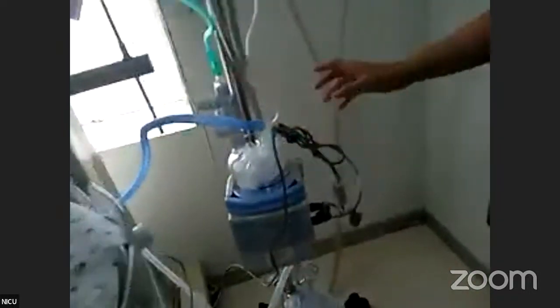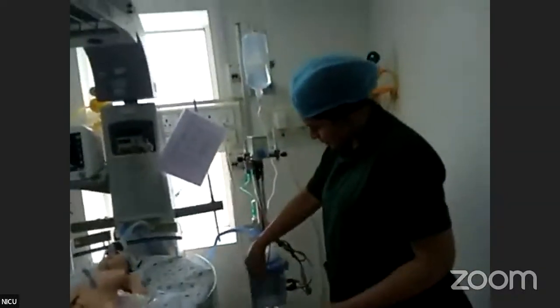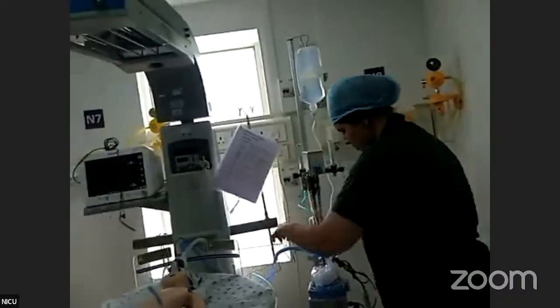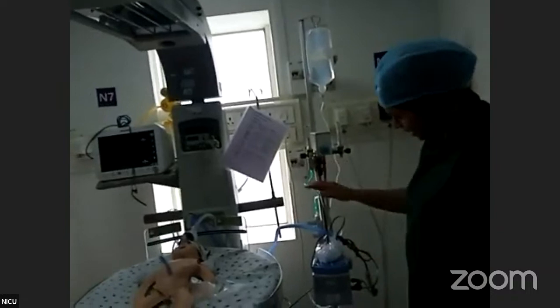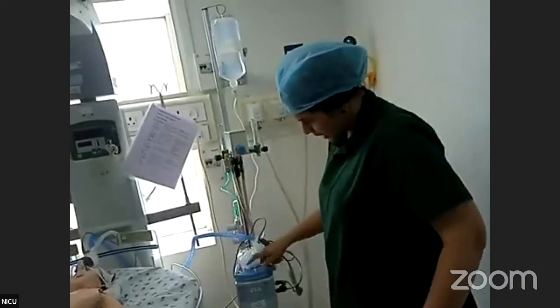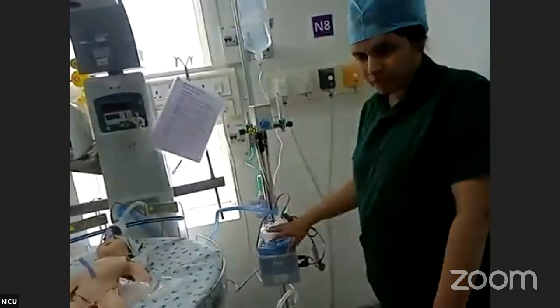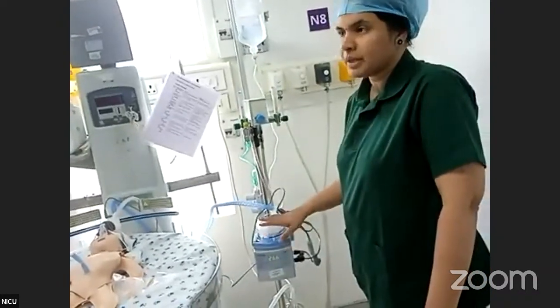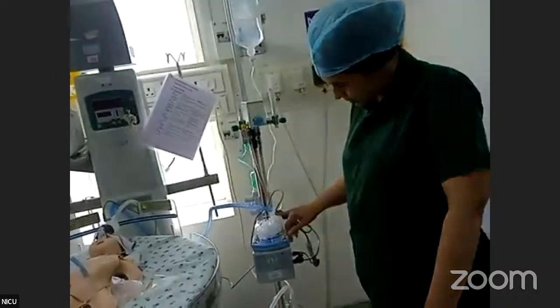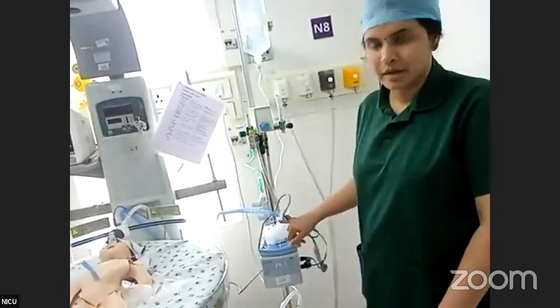Now, another very important aspect of monitoring is the presence of continuous humidification. So we just switched on the humidifier now. We discussed in the first session something about humidification, but we will discuss again the vital aspects. The blended mix of air and oxygen flows through the tubing and reaches the heated humidifier, where it goes through the multiple ports of the humidifier chamber, passing through heated water vapor, becoming heated as well as humidified. As it exits from here, the temperature should be at body temperature, which is 37 degrees with 100% relative humidity.